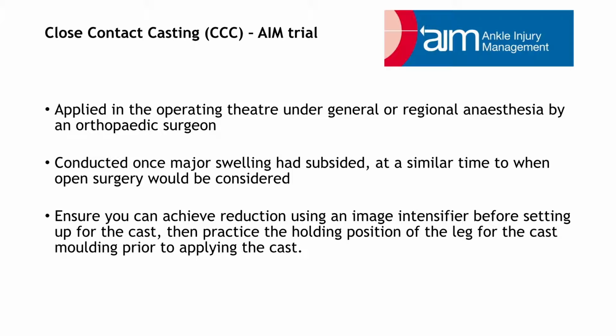We advise that casts should be applied once major swelling has subsided, at a similar time to when open surgery would be considered. Ensure you can achieve a reduction of the fracture using an image intensifier before setting up for the cast. Then practice holding the position of the leg for the cast moulding prior to applying the cast.